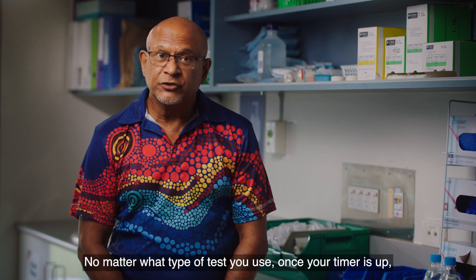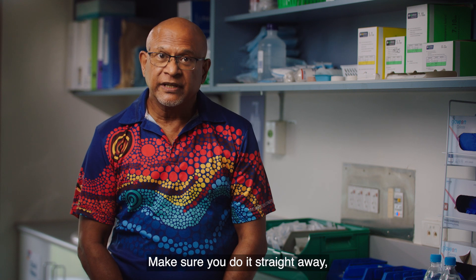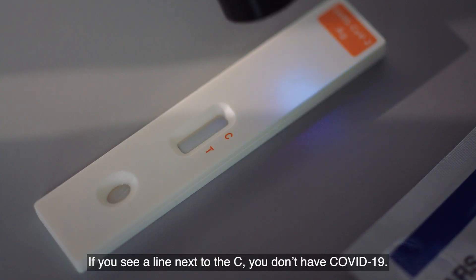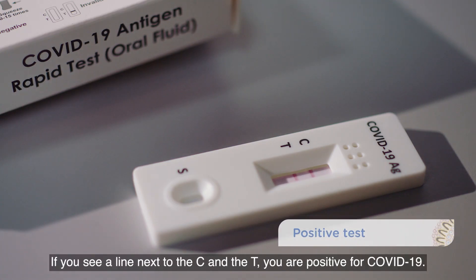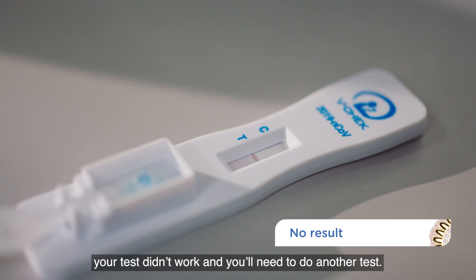No matter what type of test you use, once your timer is up, check the strip to see what it says. Make sure you do it straight away as it can be inaccurate if you leave it too long. One RAT even has a torch to help you read the strip. If you see a line next to the C, you don't have COVID-19. If you see a line next to the C and the T, you are positive for COVID-19. If you only see one line next to the letter T or no lines at all, your test didn't work and you'll need to do another test.